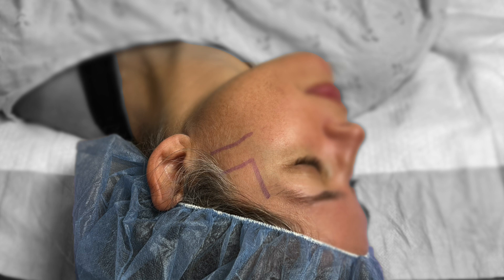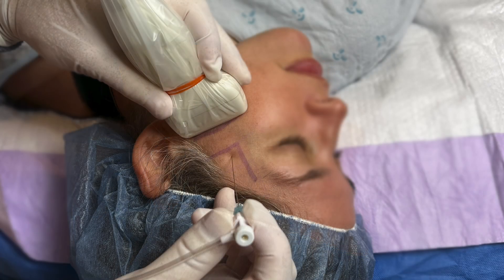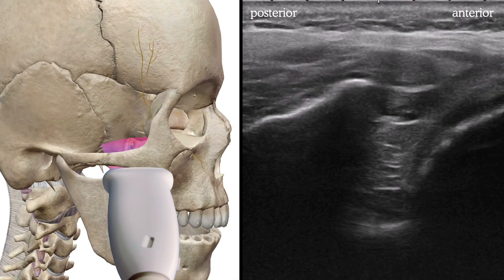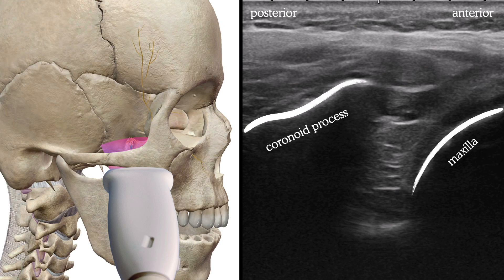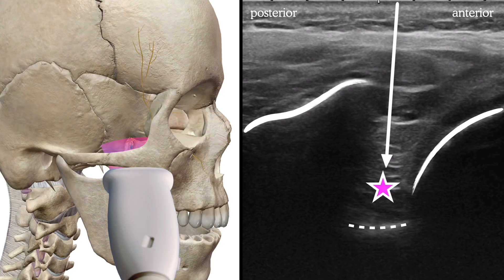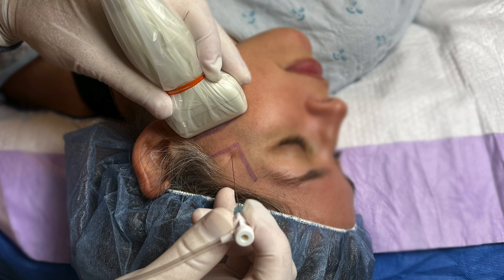Here's how to get the right picture. We've drawn out the margins of the zygoma and posterior aspect of the orbital rim. We're going to place the probe just inferior and parallel to the zygomatic arch with a slight cranial tilt. This allows us to see between the coronoid process of the mandible and the maxilla. The two obvious bony structures are the coronoid process and the maxilla. The soft tissue space between is the infratemporal fossa, and at the bottom is the lateral pterygoid plate. The pterygopalatine fossa containing the SPG is deeper, hidden by the maxillary shadow — but that's okay.